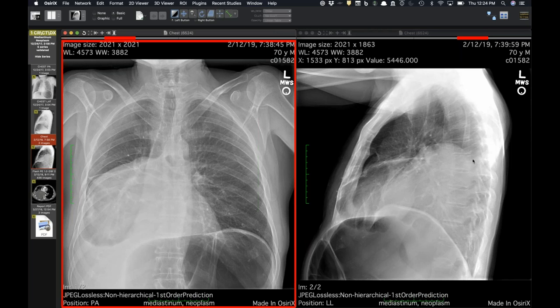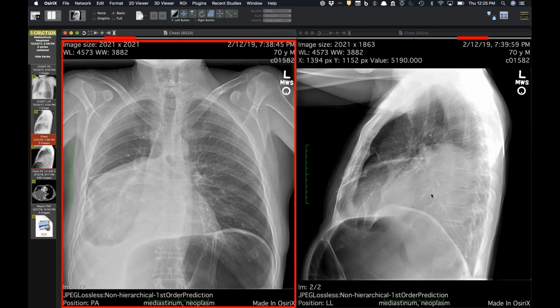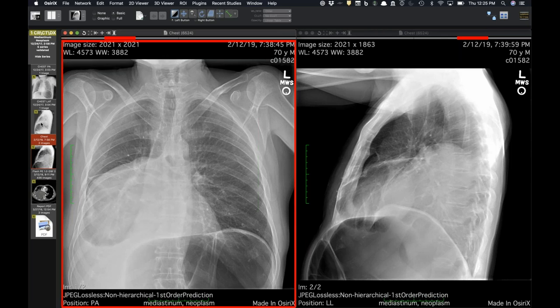In combination, you'd say it's most likely a mass or could be a loculated effusion. The vessels in the right lower lung are undisturbed and surrounded by aerated lung. Looking further out, you can see right lower lobe vessels coursing through aerated lung - so it's not an intrapulmonary process. It's posterior. So it's either a big hernia, maybe an elevated hemidiaphragm - probably not - or some sort of mass or pleural effusion that's just huge.